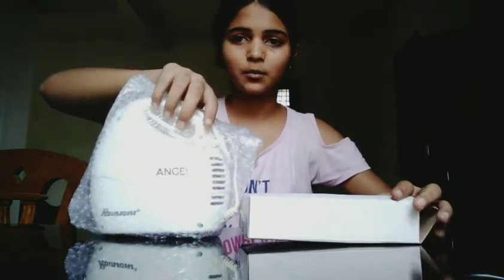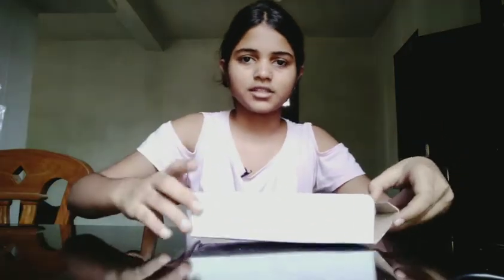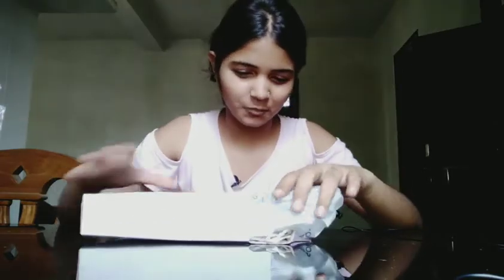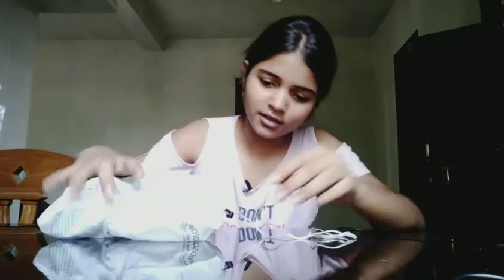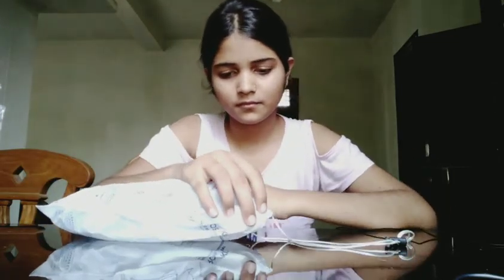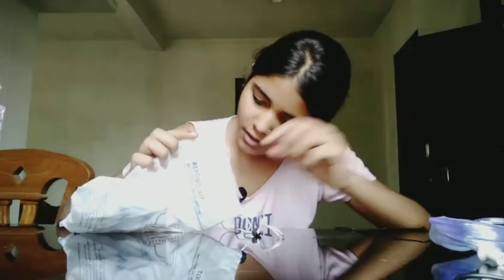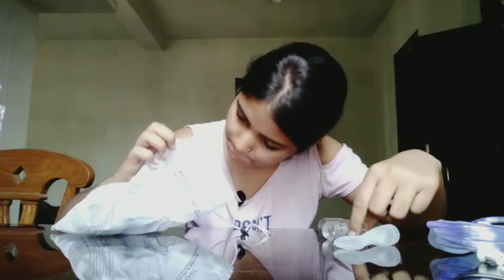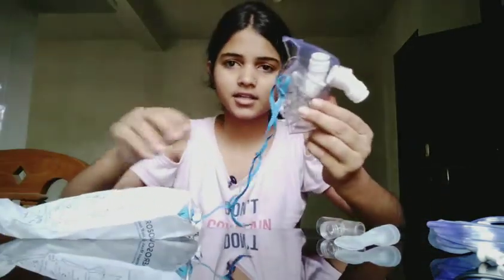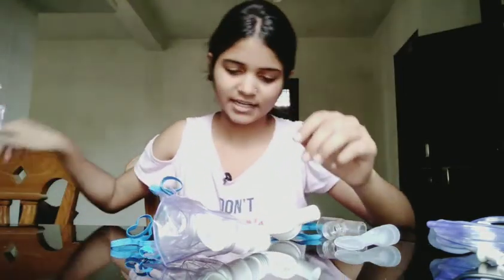So here is what we get inside the box. This is the nebulizer — the main thing — and these are some connecting instruments which you need. Let's see what is inside. There's a pouch kind of thing — let's open this up. We got a wire which has some tubes at the bottom, and we also got some masks inside.